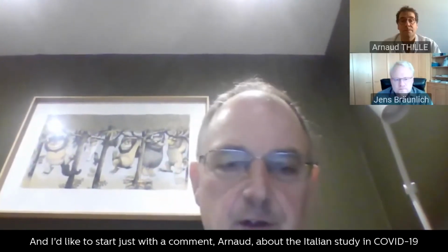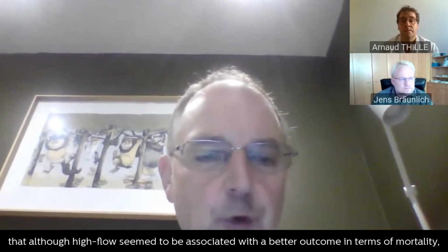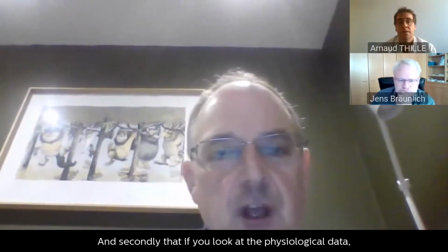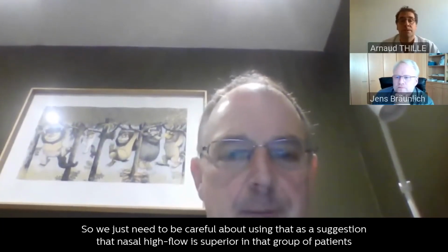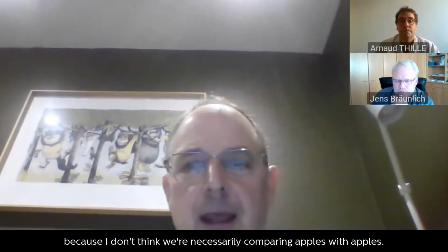I'd like to start just with a comment, Arnaud, about the Italian study in COVID-19, and just to make the observation that although high flow seemed to be associated with a better outcome in terms of mortality, it's important to note that, first of all, this was not a randomized controlled trial. It was just a large series. And secondly, if you look at the physiological data, the nasal high flow patients were actually not so severe in terms of their respiratory rate, their oxygenation, their SOFA scores, etc. So we just need to be careful about using that as a suggestion that nasal high flow is superior in that group of patients, because I don't think we're necessarily comparing apples with apples.